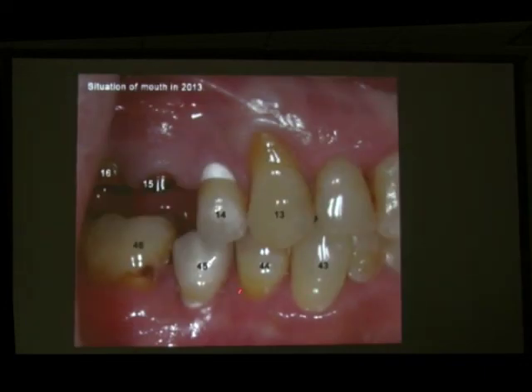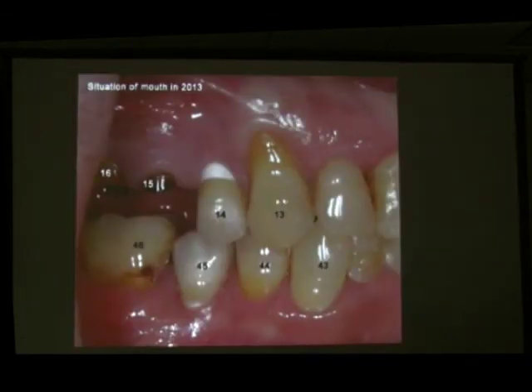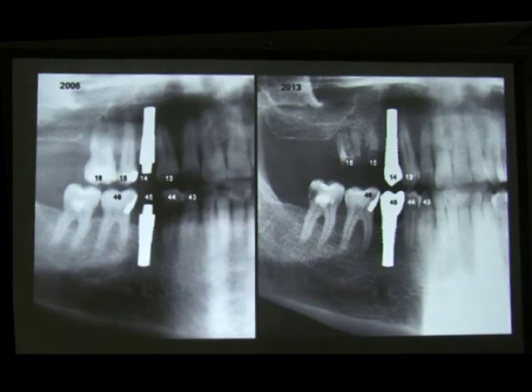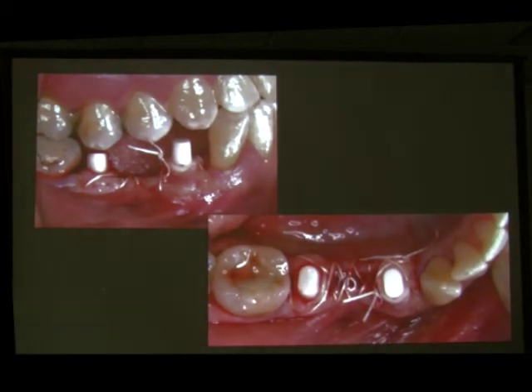And look, 2013, 7 years post-op, we have, of course, more implant exposed, just the same way as the canines have had more recession, but the bone level is completely preserved, even with horrible cleaning hygiene. So, lucky for us, many times patients have decays, but patients with decays normally do not have periodontal disease, and this is the situation. So, extremely stable, even in a very difficult technique. And yeah, so thank you very much.